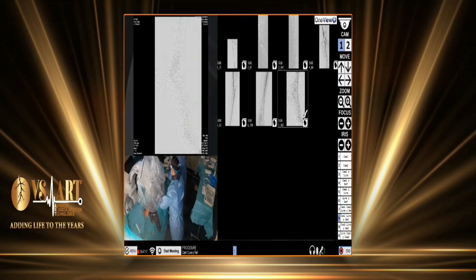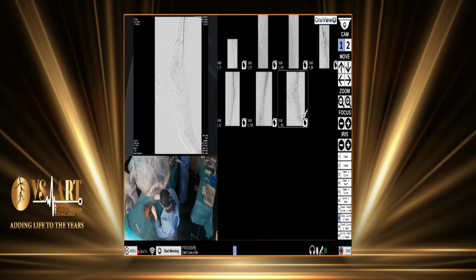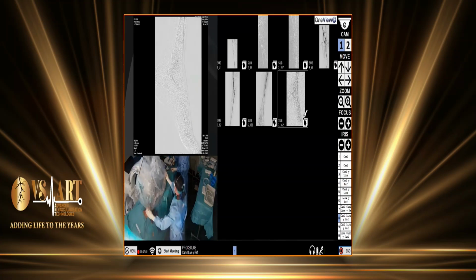Yeah, many of our patients have kidney failure. Sometimes we have patients with contrast allergy. So we are training different colleagues to use CO2, because it's difficult to visualize the first times using CO2 in comparison with contrast. In my case, I use it in 60–70% of the patients, even those that don't have renal insufficiency, because for me it's more comfortable and safe.